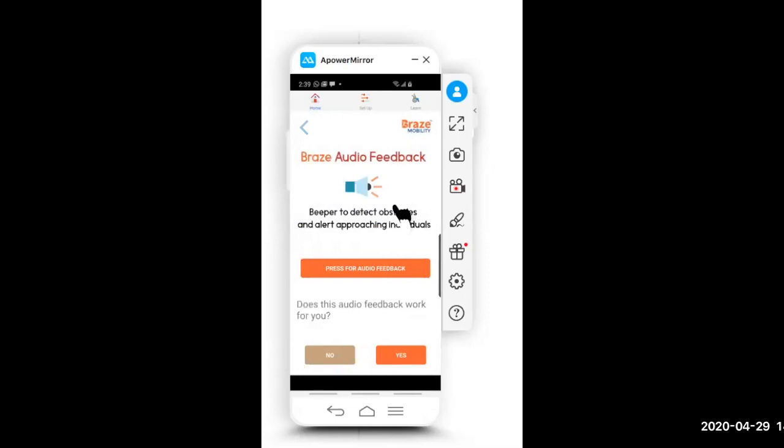And so what I want you to imagine as how you would use this is, say you have a client, you have a user, and you get them to do a simple maneuver, so perhaps backing into a wall or some sort of object. So they're doing this, they're backing in slowly. Now what you want to be able to do is give them a cue when they're getting too close and see how they respond. So let's say you see the client moving in towards the wall and they're getting within maybe that 1 foot mark. Maybe they need longer because maybe they have a delayed reaction time. So what you want to do is, when you think it's appropriate, give them a warning.